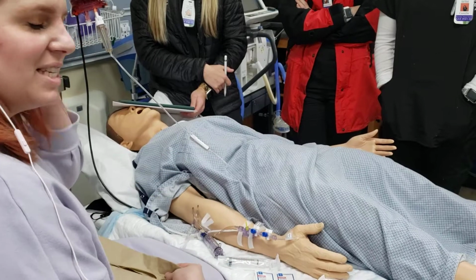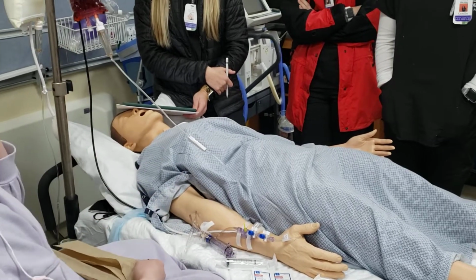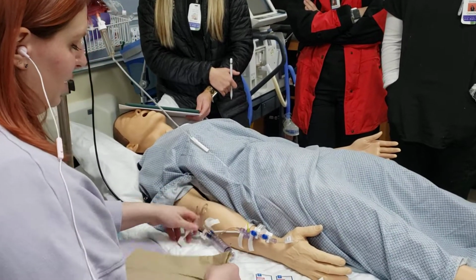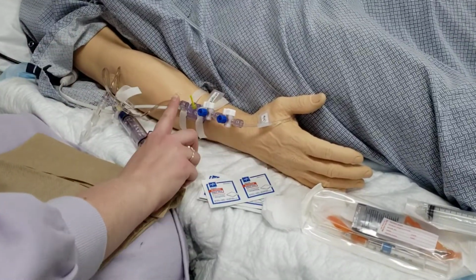For 2160 videos. This is arterial line draws. This is a little bit different than normal patient setup, but it's kind of the basic gist. So a few things that we're going to need. This is both a safety set and a stopcock setup with a transducer.